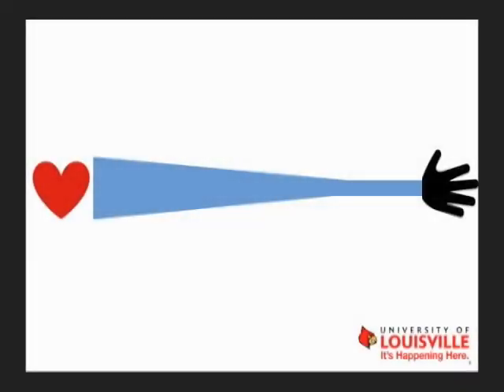If you think of natural venous anatomy, veins get larger as they go to the heart. In addition, in a vascular access, the blood flow is flowing in the same direction as the veins are increasing in diameter. If an undersized stent is placed, it will migrate forward because there was nothing for it to hold on to keep it in its proper place.